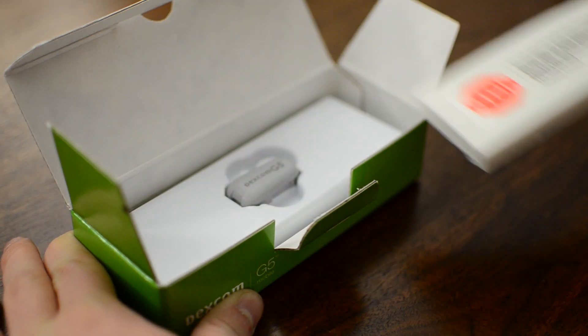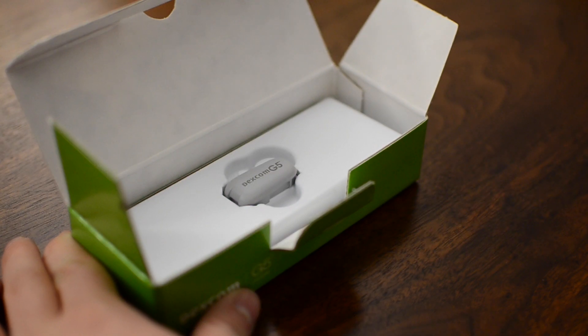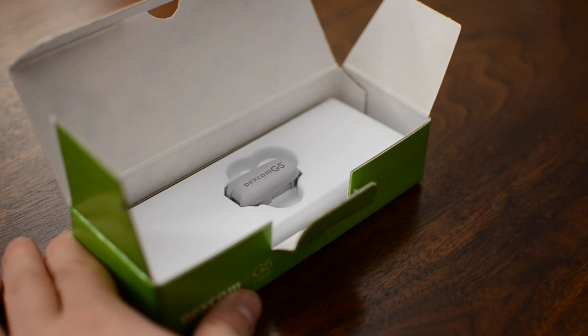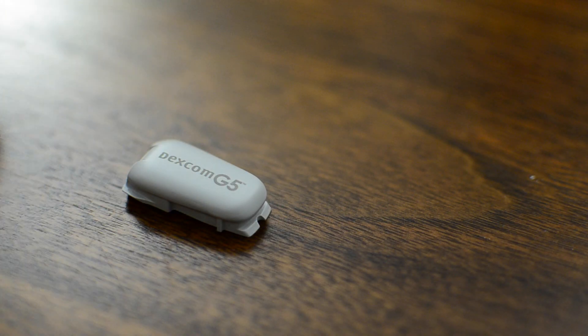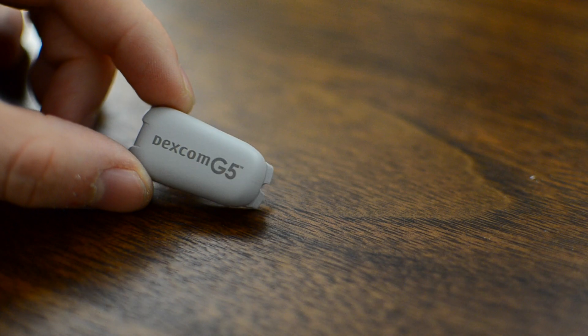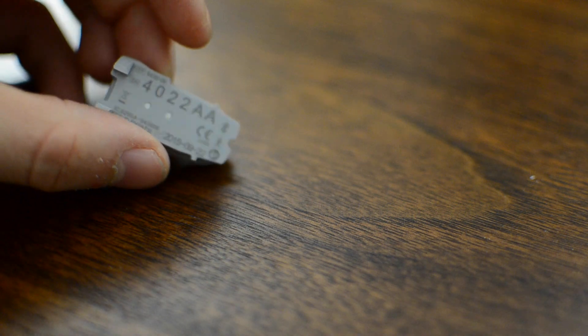The big difference between this and the last generation G4 is that you can essentially use the G5 completely independent of a receiver. That was a big hang-up for a lot of people having to carry that receiver around. Now with this new G5 sensor, everything is built in. It just uses Bluetooth and goes straight to your phone.